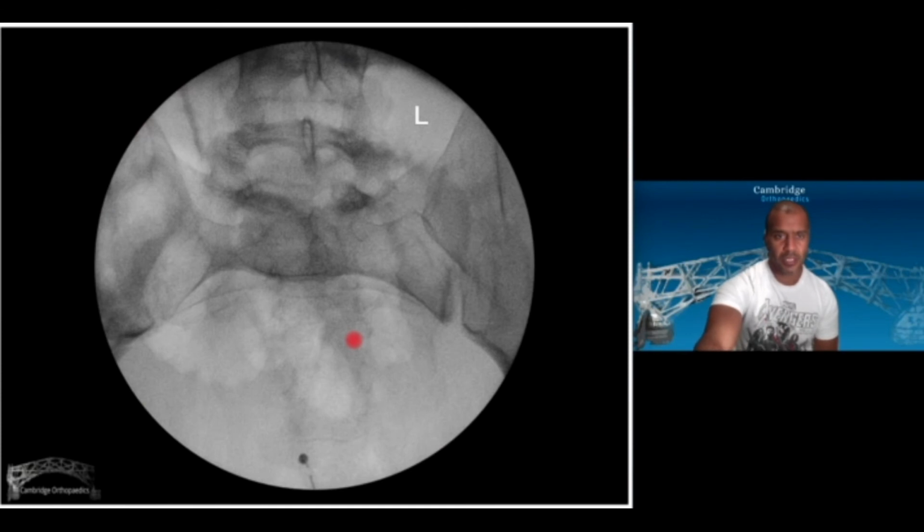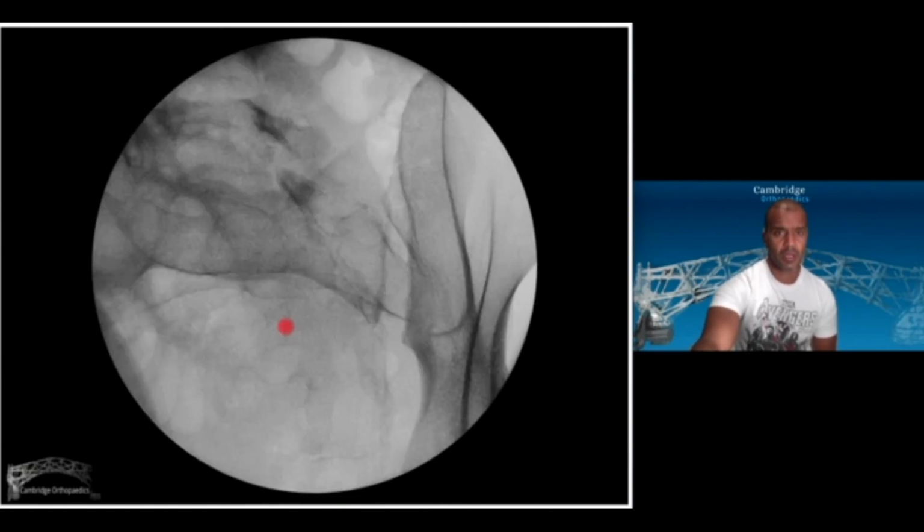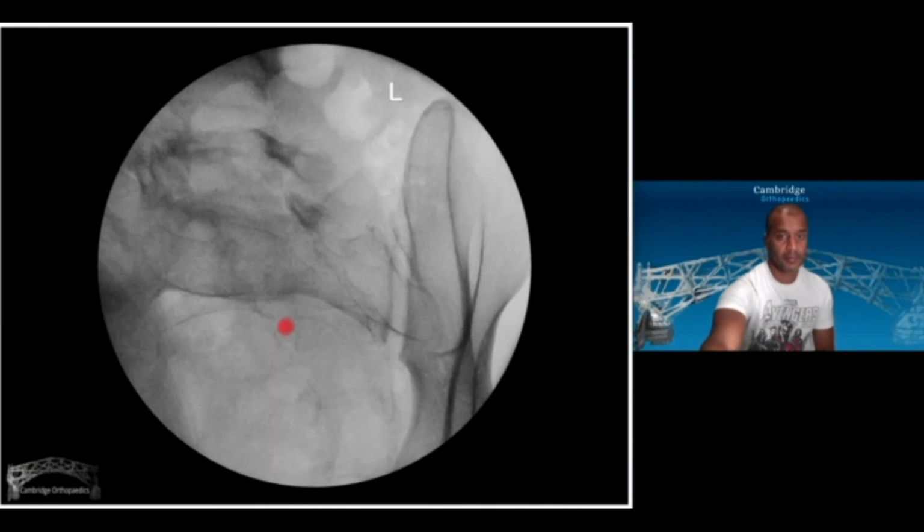So here's our inlet view. We can have a suspicion of a wide open SI joint on the left hand side, and that's the crescent coming into the sacroiliac joint, and then testing it, a bit of a figure of 4 position on that left leg really opens up that SI joint quite dramatically, which closes on a bit of compression.